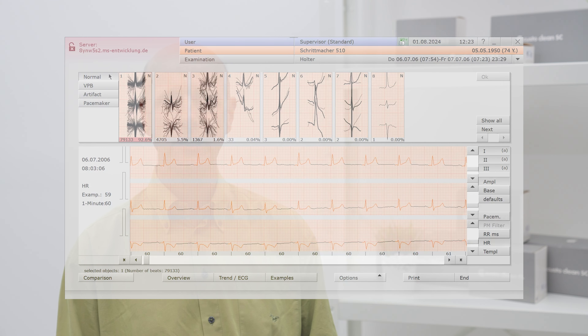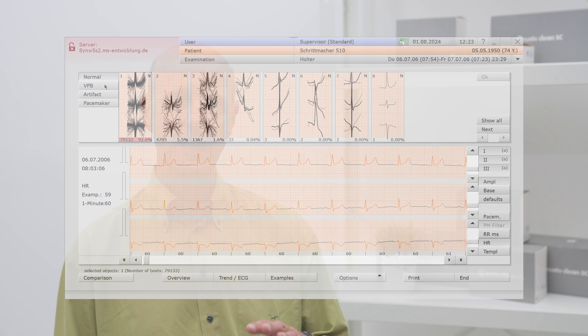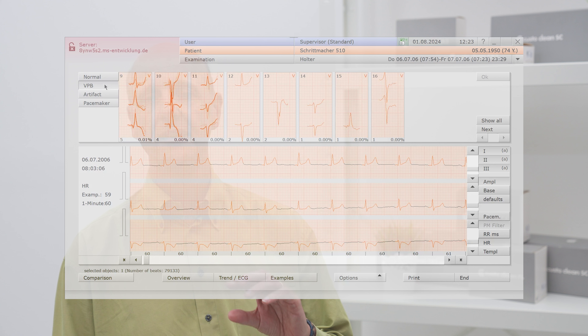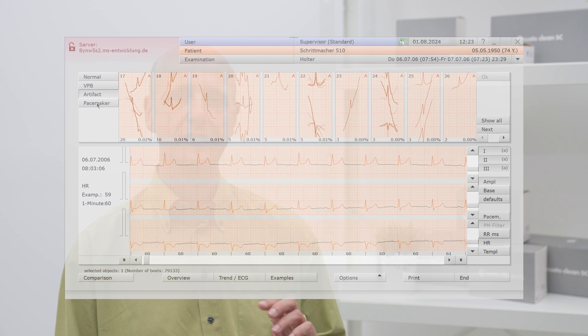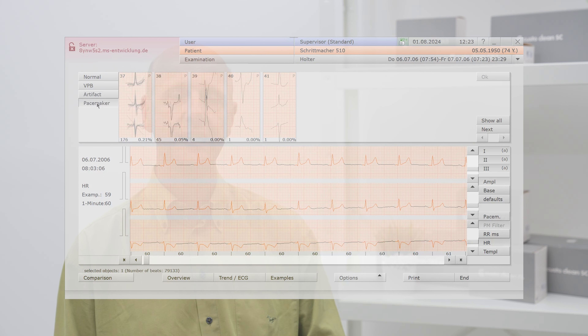There have also been slight changes to the template page. Because we use all three channels we need a bit of space for the templates, and have therefore placed the normal beats, the ventricular beats, the pacemakers, and the artifacts in their own line, which you can then click through and check individually.